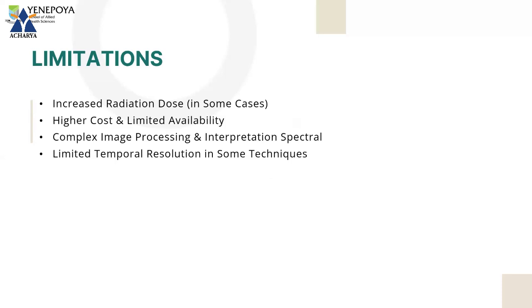It is not at all cost effective because of the advanced detector technology being used, and the computational processing, which is completely different from conventional CT. Because of this, it comes with a much higher cost.